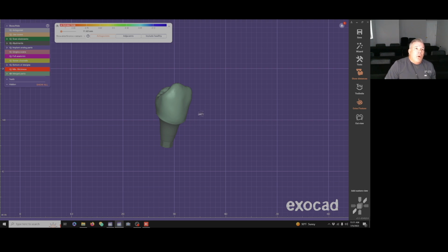So what we did is we took a radiograph and it looked like a custom abutment with a crown. So I figured the access hole for the abutment's got to be on the occlusal surface. So we actually went in and we found it right away, uncovered the screw, unscrewed the screw, and took out the crown and the abutment. And what we found was a ton of cement around the abutment and around the top of the implant.